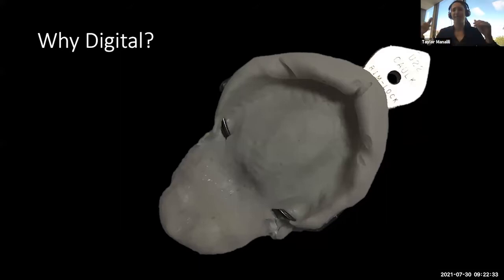And we always ask that lab that wonderful question when they call to say they can't quite see something. We say, can you make it work anyway? Right? So that is a beautiful part of digital dentistry: we get to see very clearly what the lab is going to see. We just have to take the time to do it.